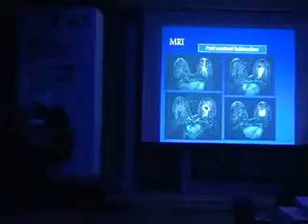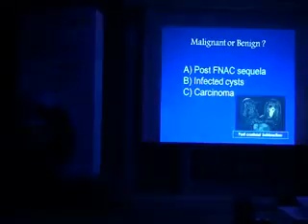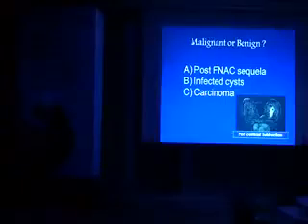Okay. I will not comment on the contrast enhancement except just give me a couple of minutes to see how you would interpret these images first. Do we have enhancement? Yes, we have enhancement. But what kind and what type of enhancement do we have? We can say it is marginal, but the wall is very thick, and we have some other. But anyhow, I will comment later. So, the question is, is it benign or malignant?